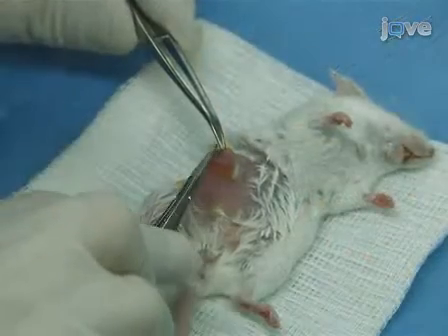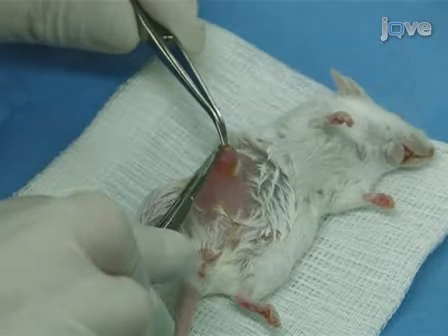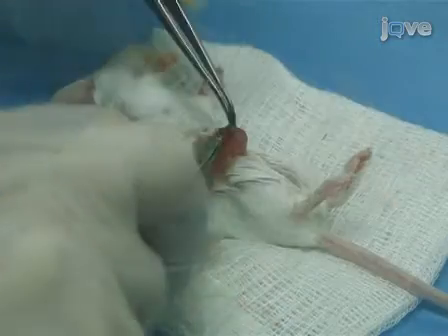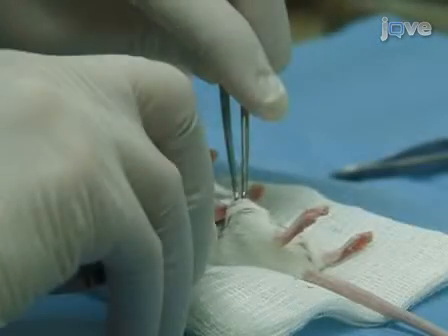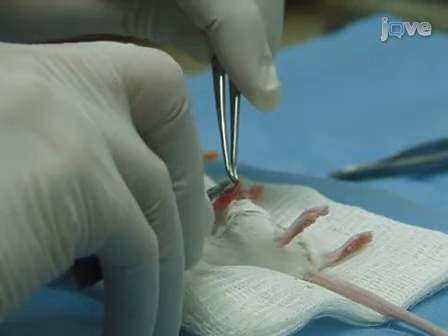With the animal on a sterile surgical cloth, pull the skin immediately medial to the nipple using forceps and cut an approximately 2 mm incision. Separate the underlying mammary fat pad from the skin using dissection scissors and forceps. When separated, the skin and hole stretch to a size that will accommodate insertion of the MIW.